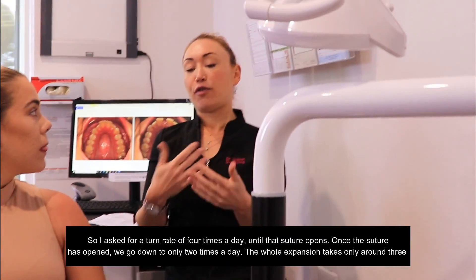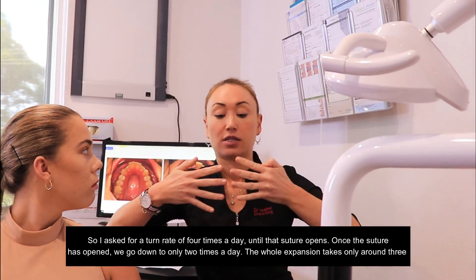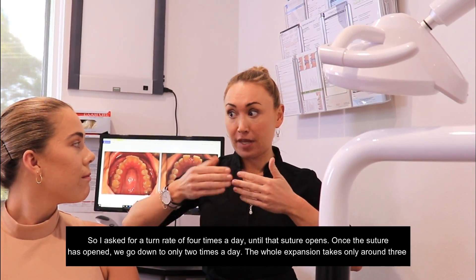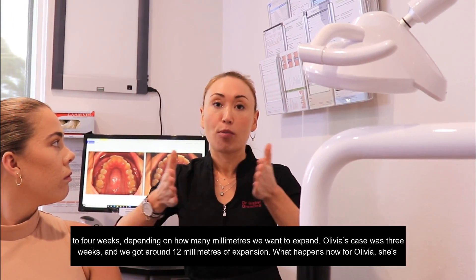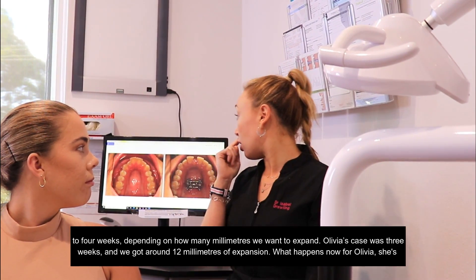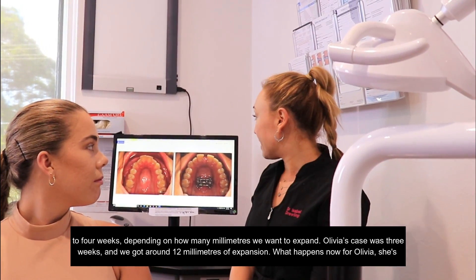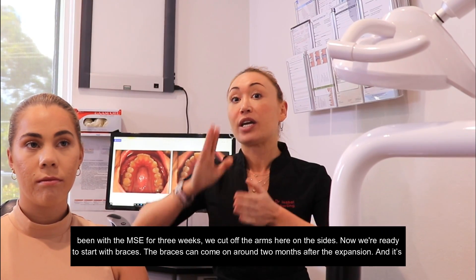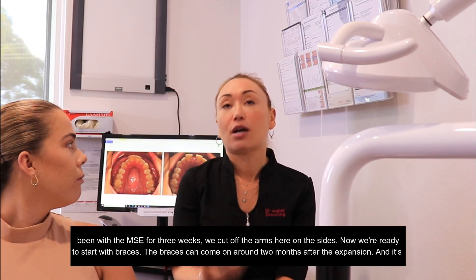I ask for a turn rate of four times a day until that suture opens. Once that suture is opened, we go down to only two times a day. The whole expansion takes only around three to four weeks, depending on how many millimeters we want to expand. Olivia's case was three weeks and we got around 12 millimeters of expansion. So now Olivia has been with the MSE for three weeks — we cut off the arms on the sides and now we're ready to start with braces.